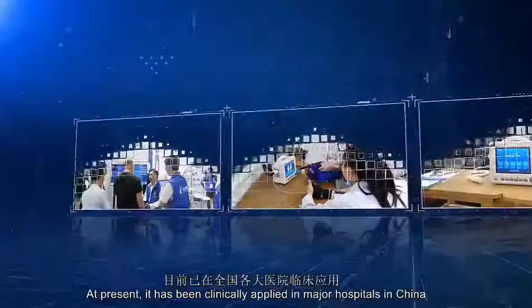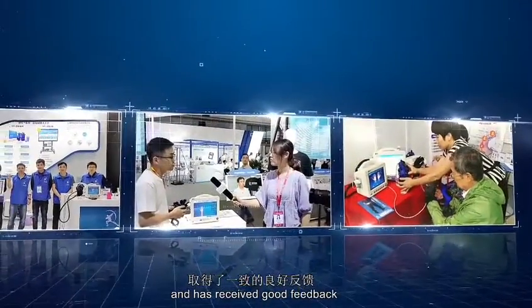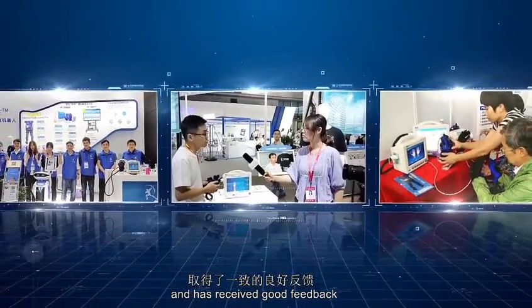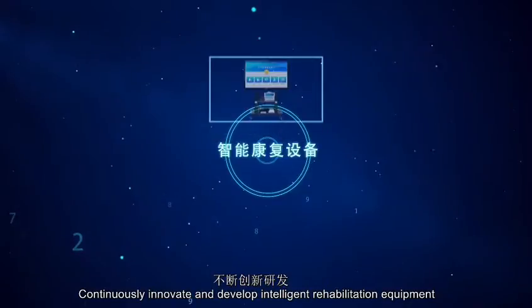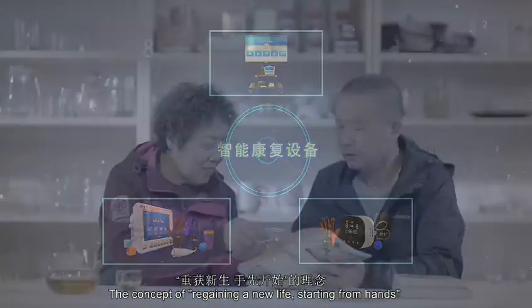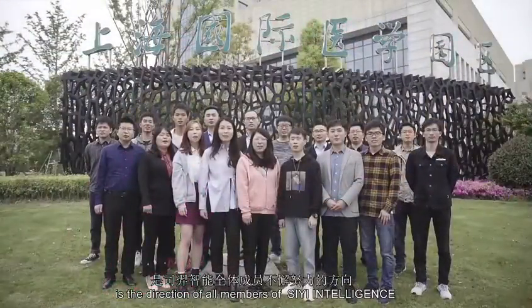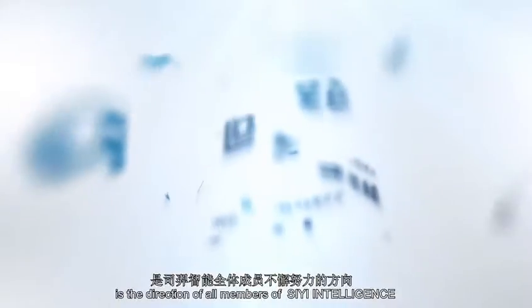At present, it has been clinically applied in major hospitals in China and has received good feedback. Continuously innovating and developing intelligent rehabilitation equipment from hospitals to home, the concept of regaining new life starting from hands is the direction of all members of CE Intelligence.